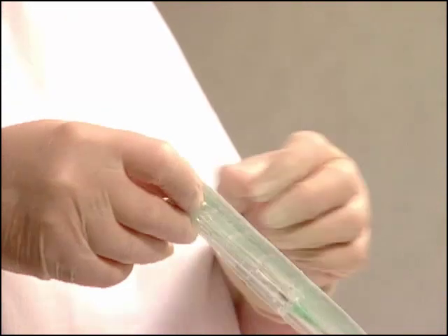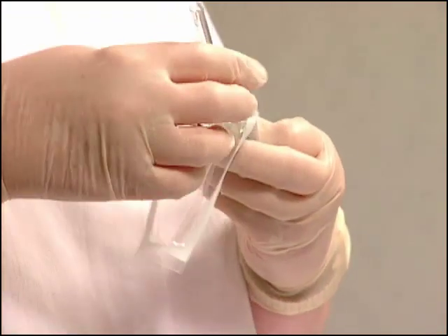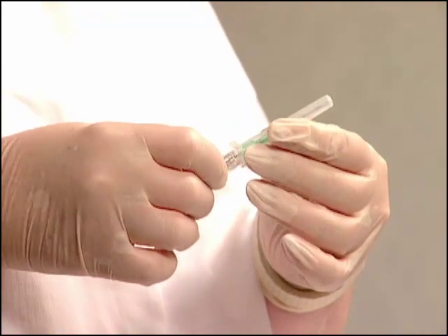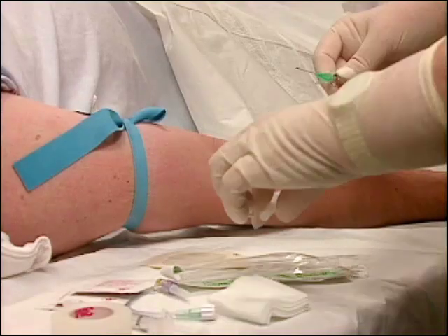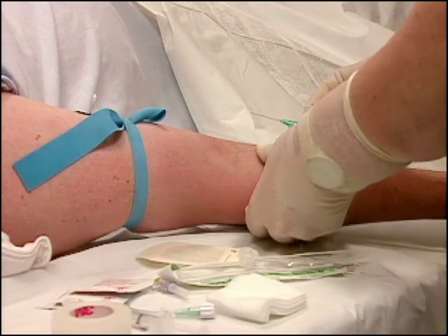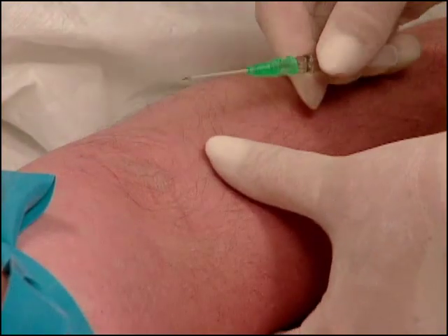Open the film covering the catheter and remove it from the package. Work the plastic top off of the catheter, taking care not to contaminate the needle itself. Take care not to slide the catheter back and forth over the needle, as this may cause damage to the catheter sheath. With your non-dominant hand, grasp the patient's arm or hand. Use your thumb to gently stretch the skin over the insertion site. This will help to stabilize the vessel.